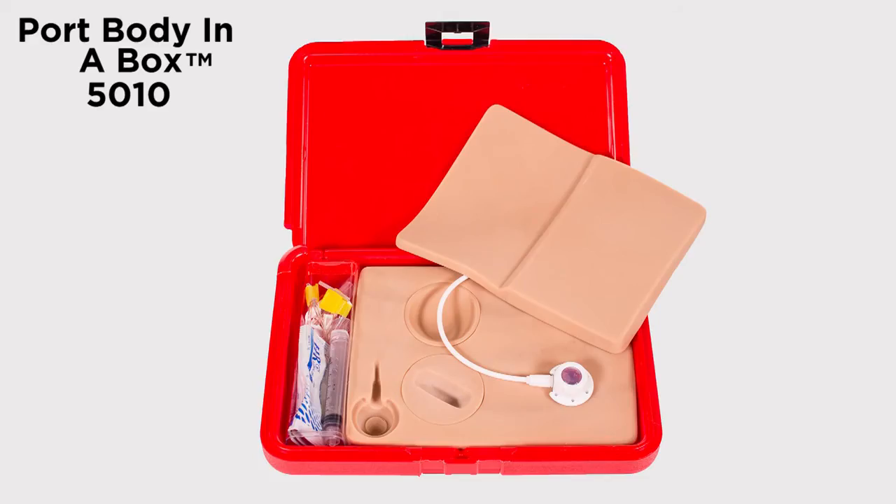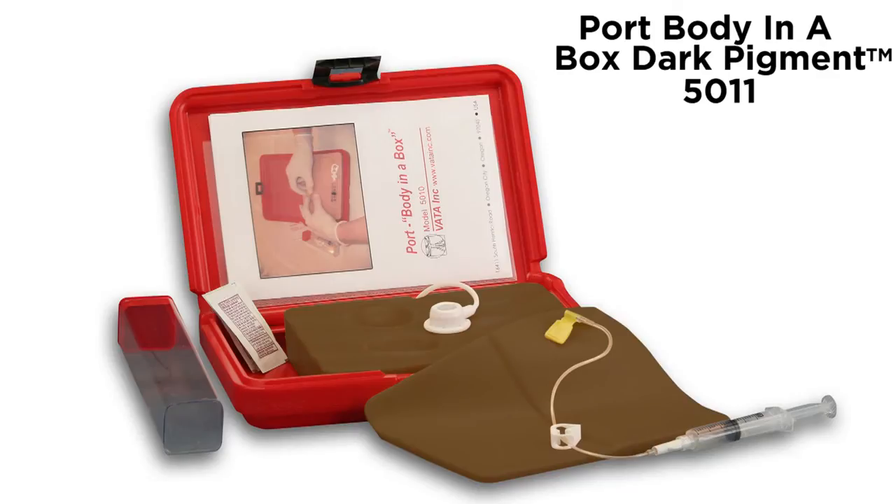Port Body in a Box Model 5010 is available in lightly pigmented and darkly pigmented colors.